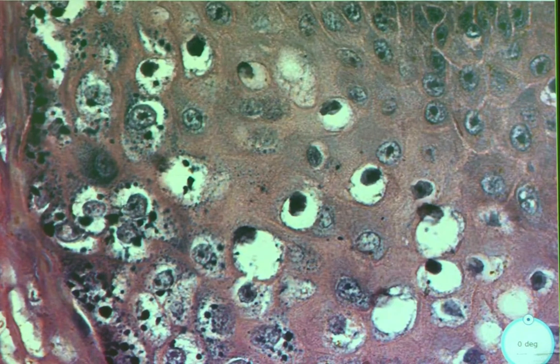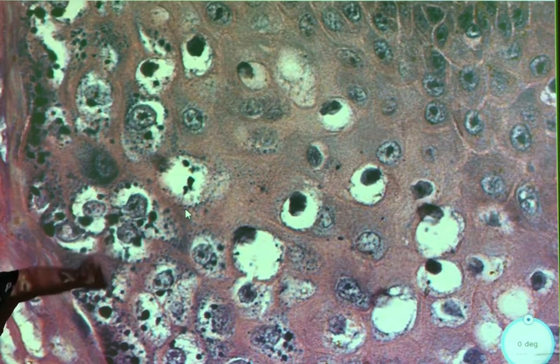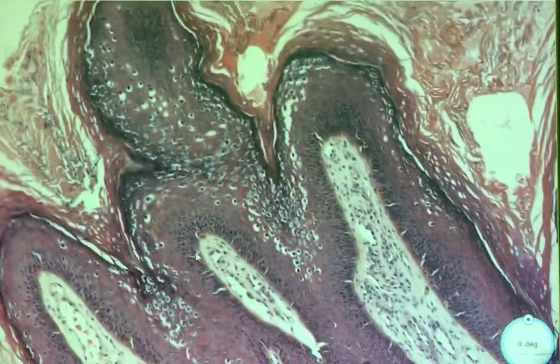Look at this beauty here. What you have here is granular layer and it's coming down. All these super dark splotches project better on the screen, but that's all related to your granular layer. So you have this hypergranulosis, which, if you remember from last week, we had lesions that tend to lose that granular layer.